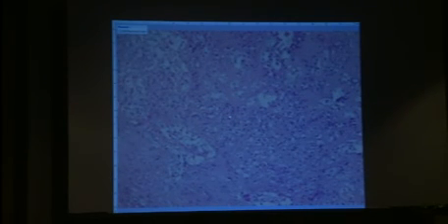With that differential diagnosis, you can also have some spindling of those cells. So I would do some immunohistochemistry to determine whether these cells are really myoepithelial or not. The necrosis may be ascribed to the biopsy. It is too much just for a biopsy, but when you think about cellular pleomorphic adenomas, you can see areas of necrosis like that. So that is my differential.